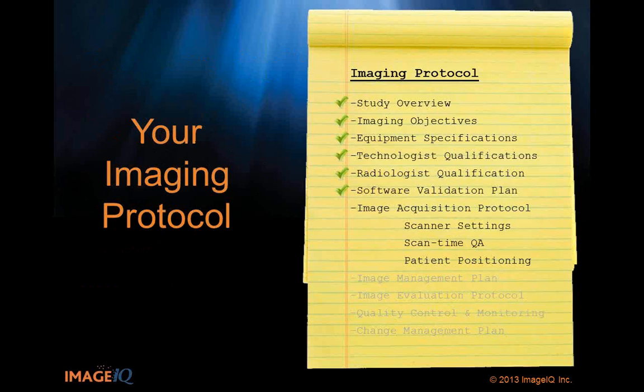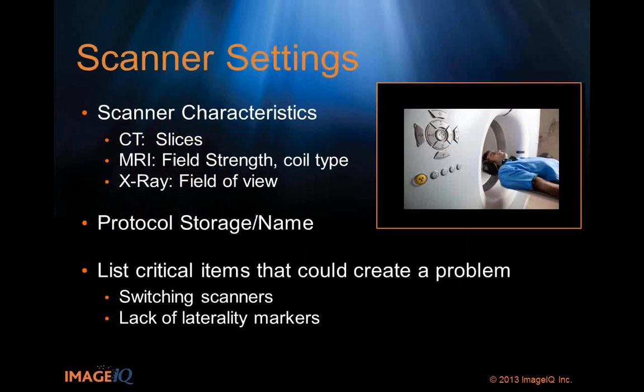So we'll go from that to image acquisition. Amit and I both have some sections here as we start to dive in. Interestingly, this is what we see most of all when someone asks us to review their imaging protocol. They've really focused on this next section. And while that is super important, and somewhat the easy part, it's what we all automatically go to, it's not the whole story, as you're seeing.